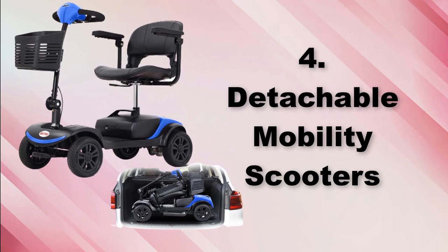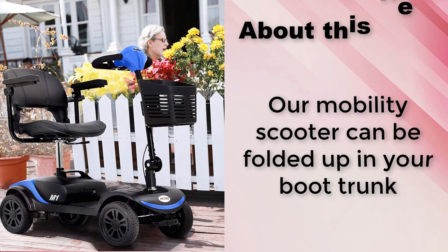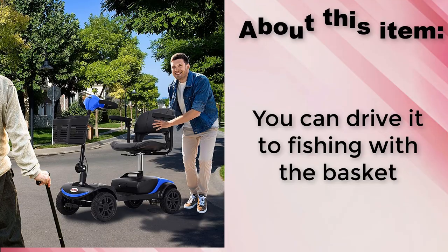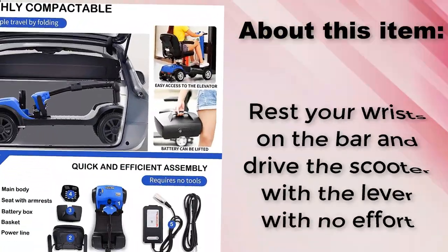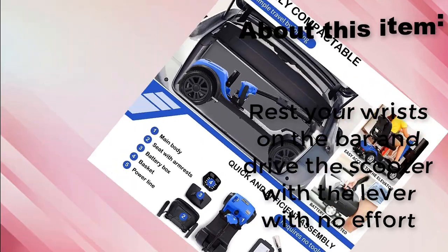Detachable Mobility Scooters. The scooter can be folded up in your boot trunk. You can drive it to fishing with the basket. Rest your wrists on the bar and drive the scooter with the lever with no effort.